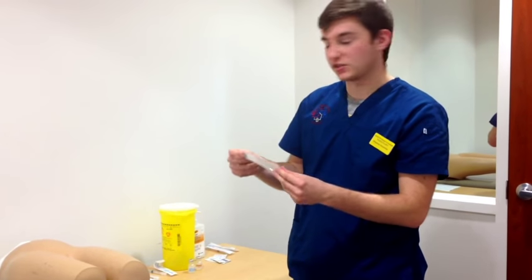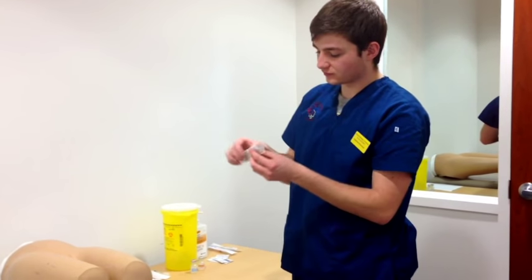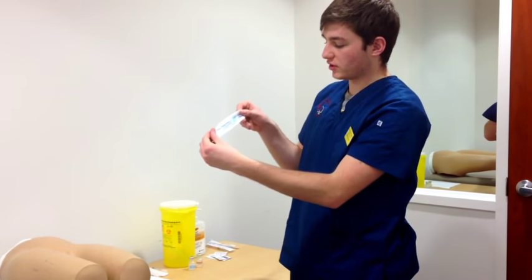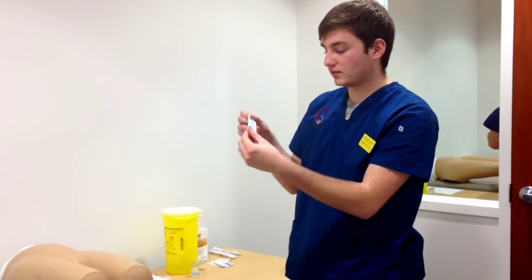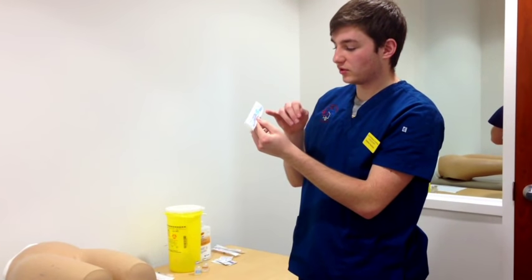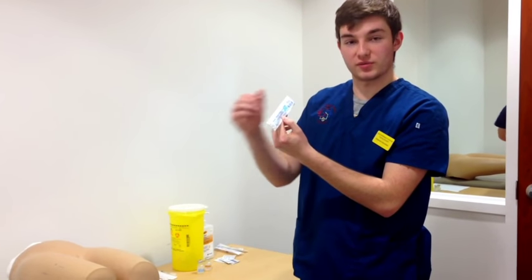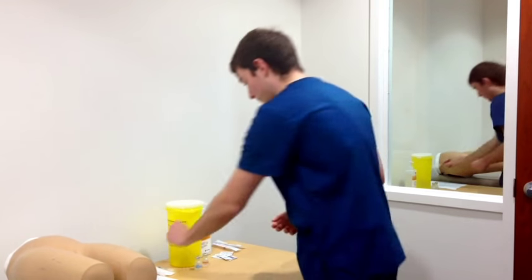That is appropriate for subcutaneous injections. Next, we're going to look at intramuscular. On the syringe, we have 0.65 diameter, or 23 gauge, which is appropriate for the client as well as for intramuscular injections, and 25 millimeters in length, which again falls in the appropriate range for intramuscular injections. So we have the right equipment there.